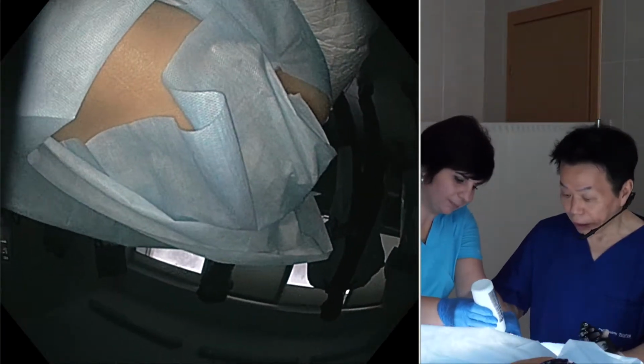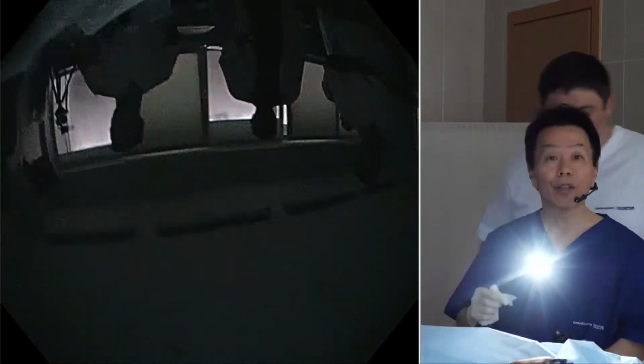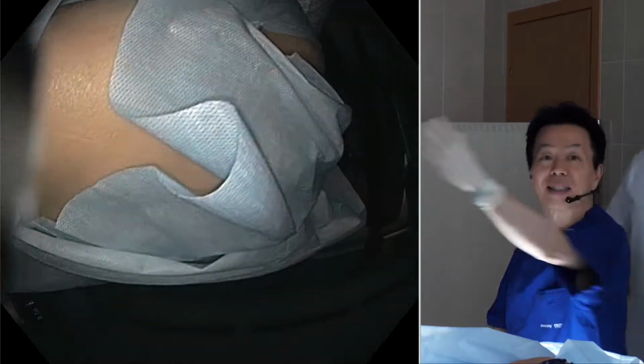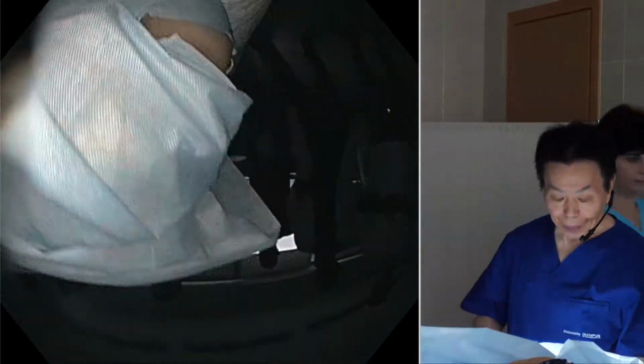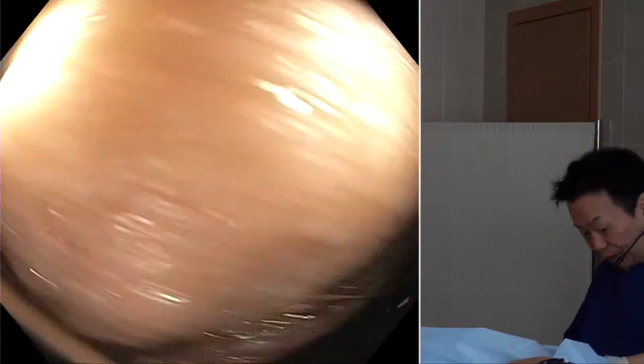So would you put some jelly on the scope? And can I have the gauze to hold the scope? And I usually have the screen in front of me here, not here, but today I have the screen here, on the opposite side. So anyway, let's start.